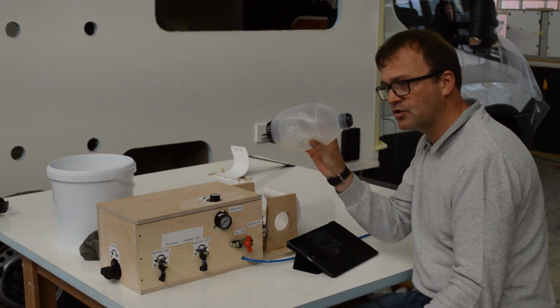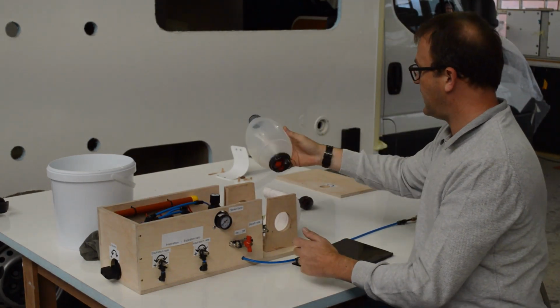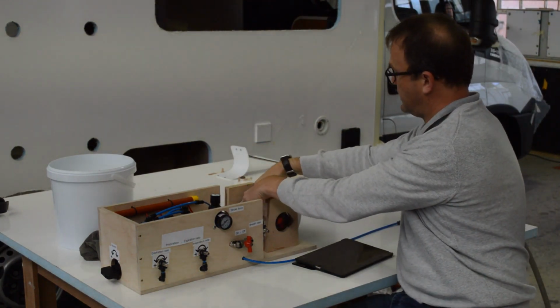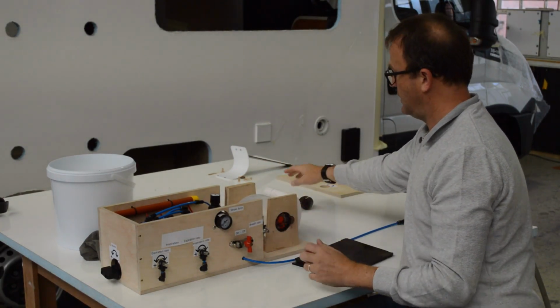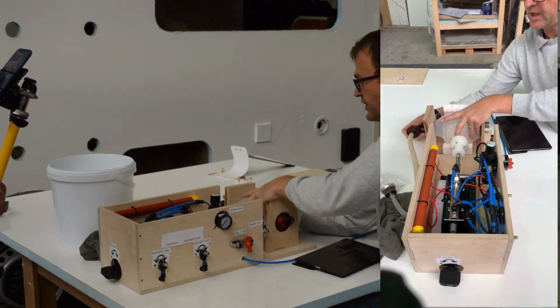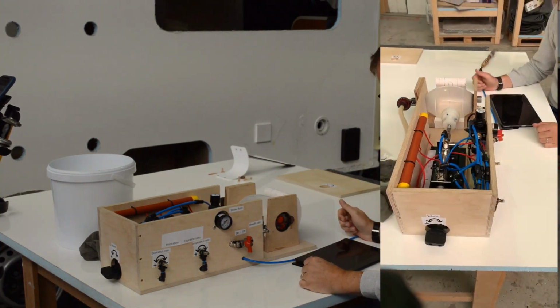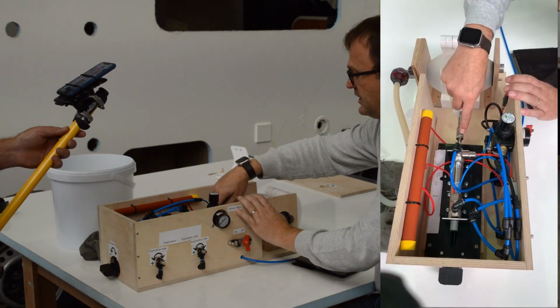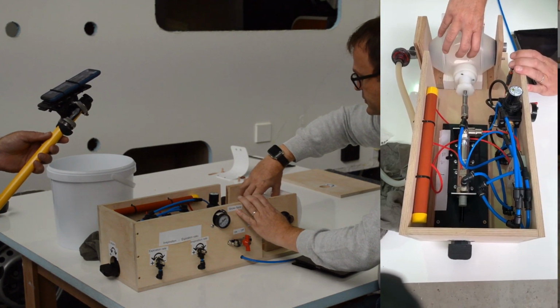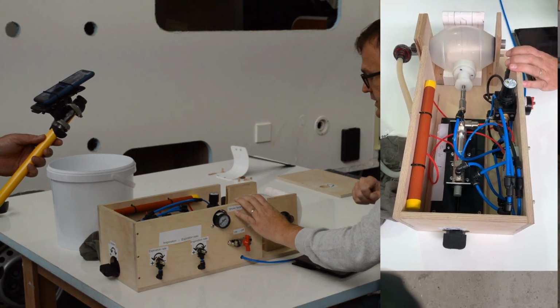Anything to the patient goes through the BVM. So the BVM itself, any BVM can be used. It's very adjustable in size. So the only thing that happens is it goes in there and then it sits in. Then your valve goes on the end and that takes care of that. Obviously the BVM oxygen side is over here as well. Then the cylinder also is pressure sensitive, so you can set the pressure. If there's too much restriction, the stroke will come back automatically and then start again. We'll show you that as well.